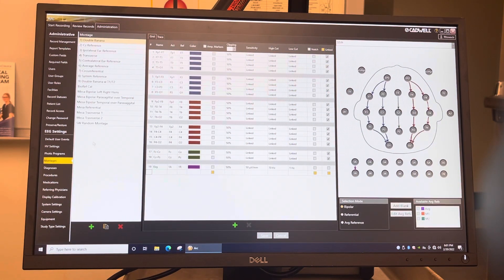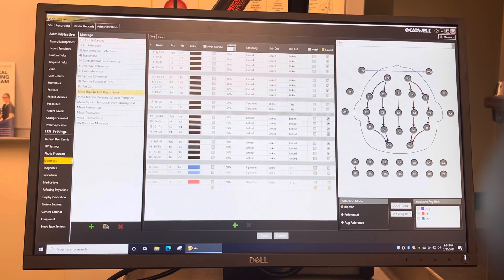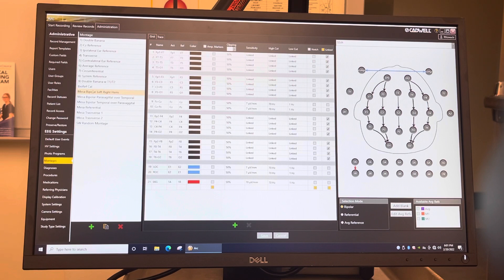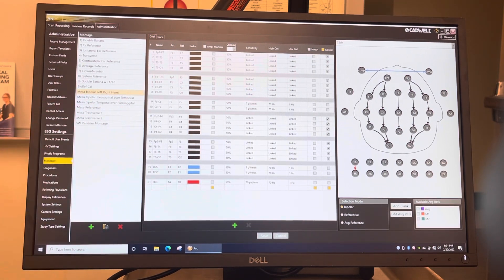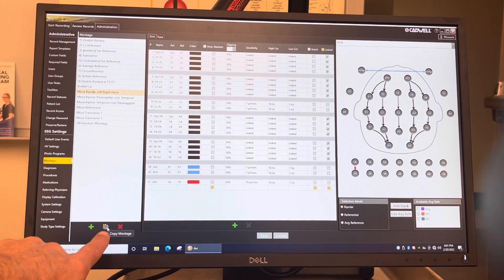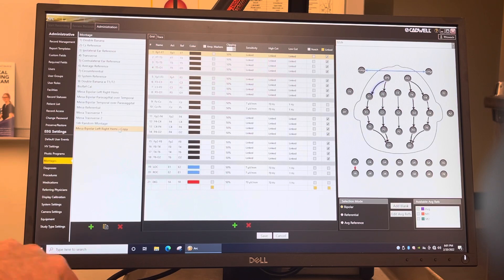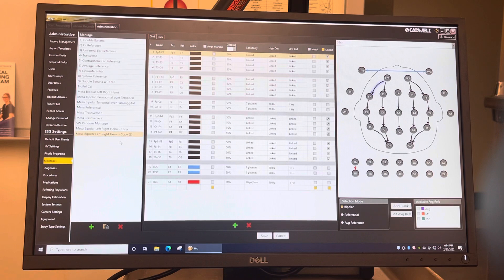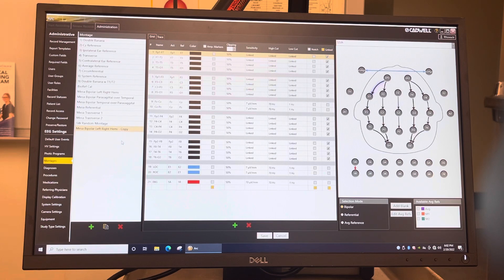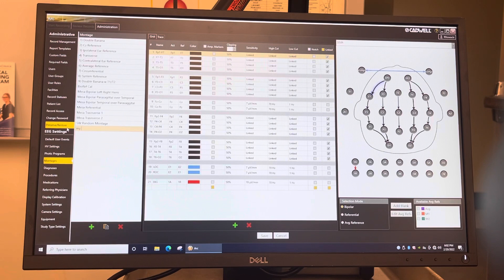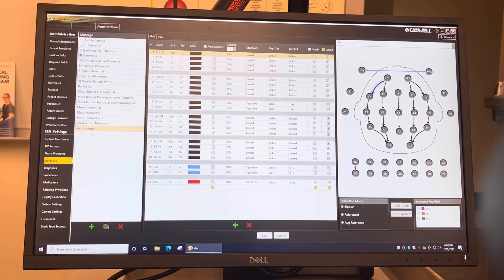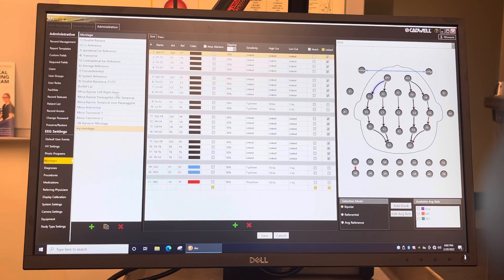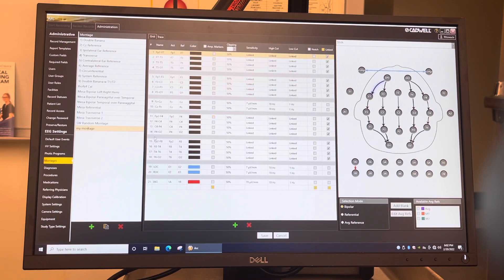So let's say you just want to copy a montage. Let's say you're looking at this right over left hemisphere one here. Let's say you want a copy of the mesobipolar left over right hemisphere. So you highlight it, and then you just click on this copy montage down here. It'll say copy right here, and then you can just rename it. We're going to delete that one. So you click on it, and then you just type, you highlight it and just type my montage. So now it's the exact same copy as the mesobipolar left over right hemisphere. So if I click on that one and click on mine, it's the same one.